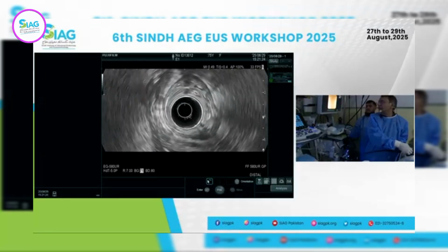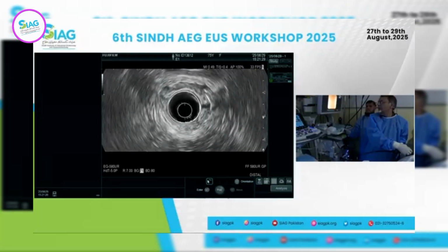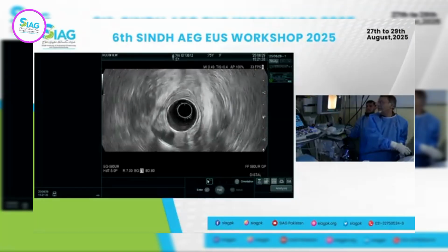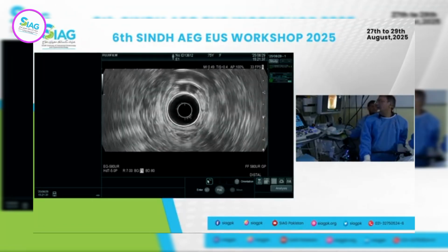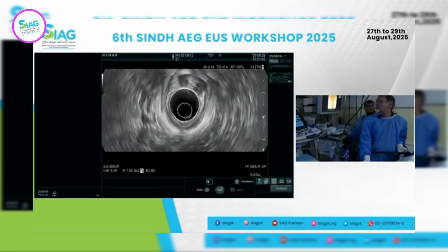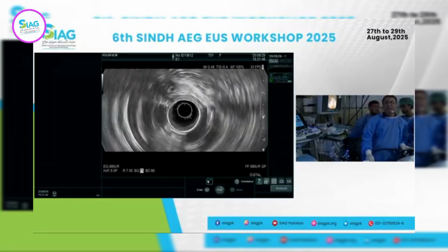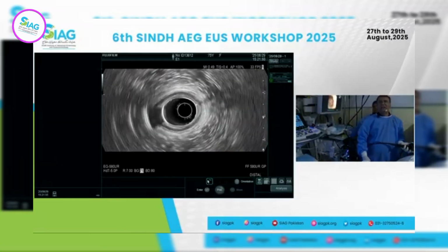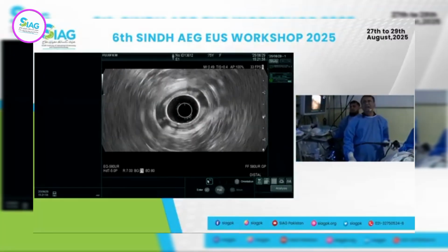I lean on the other side. Looks pretty good there. Now I can use the big wheel and the up and down, and lean on the walls on each side. I have not seen any mass there, and even here, pretty okay. Don't see anything. We're getting close to the distal area, so I'll go back and look for that rectal ulcer, and put the probe right on there and see if I find any wall thickness.